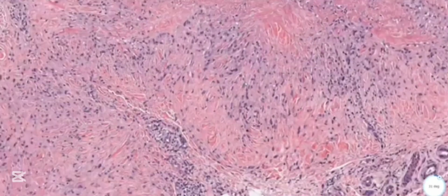This is also forming a fence. This palisade is usually composed of lymphocytes and macrophages. And whenever you see this, this is called palisaded granulomas. And when we talk about palisaded granulomas, your list of differential diagnoses includes granuloma annulare, NLD, which we talked about, the necrobiosis lipoidica.